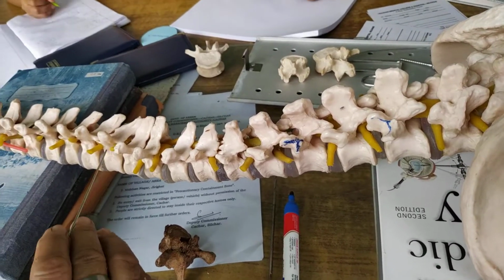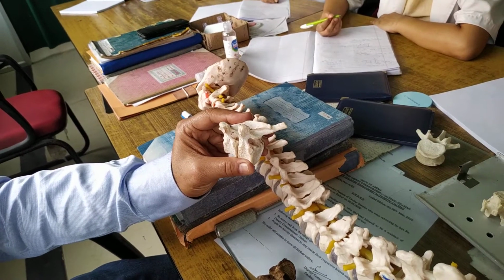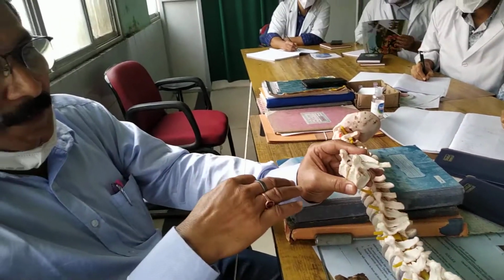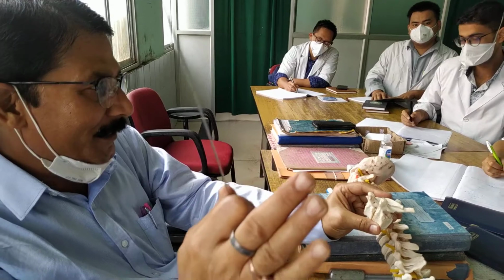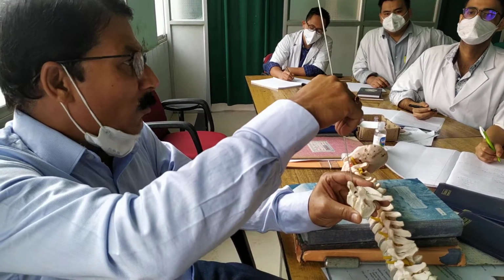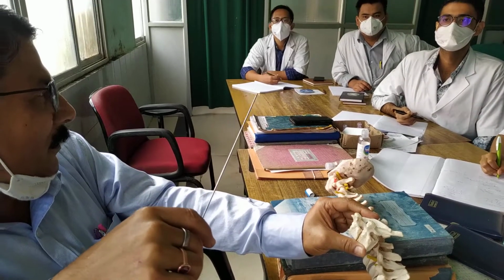So grossly in the anterior-posterior plane, the direction of your entry point will necessarily go in a caudal direction. One direction is clear. Yes, sir. Because the pedicle is caudally directed in the thoracic area, whereas in the lumbar area it is almost perpendicular. So in this axis you do not need to go. In the lumbar you are going straight. One point is that at entry I am going a bit caudal. But how much caudal it should be is determined by the lateral image.